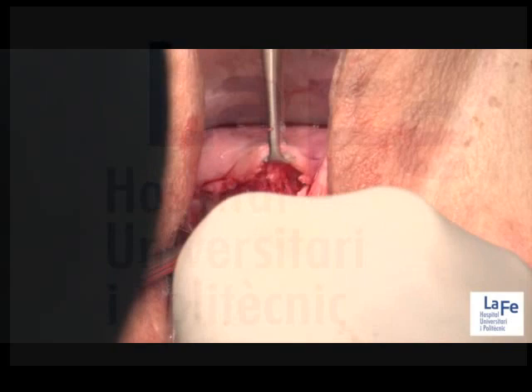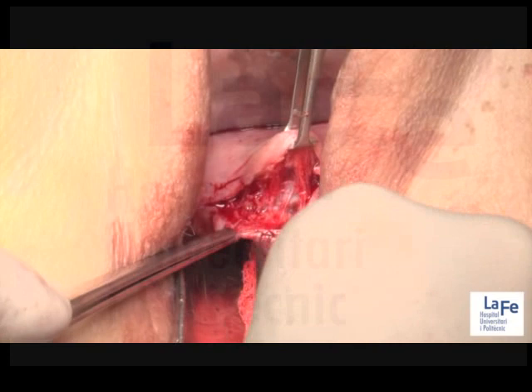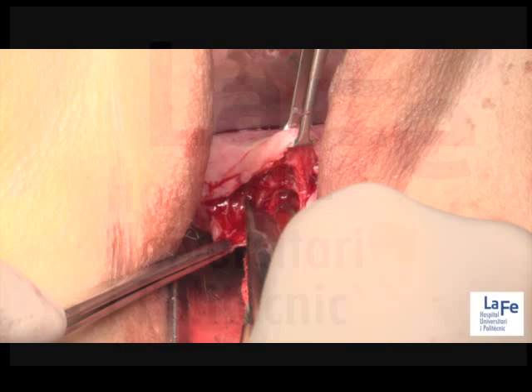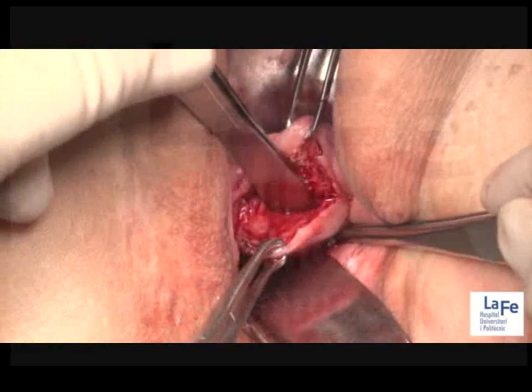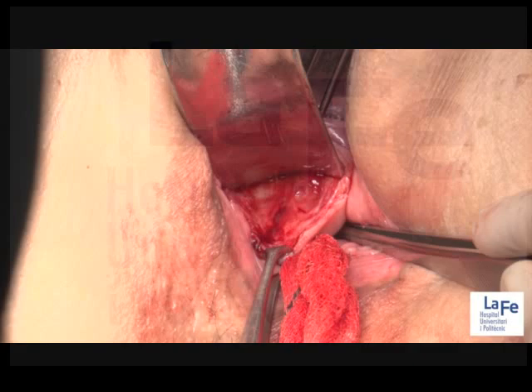At the anterior vaginal wall, the bladder is pushed upward with scissors or blunt dissection. A glove can be interposed between the tumor and the vagina before the running suture. The dissection should be enough to allow a tension-free vaginal closure. The vaginal cuff is then closed using a running suture.